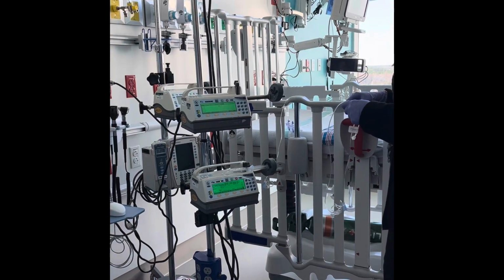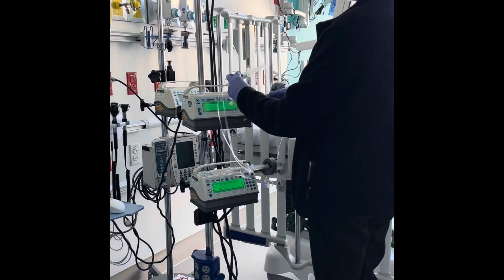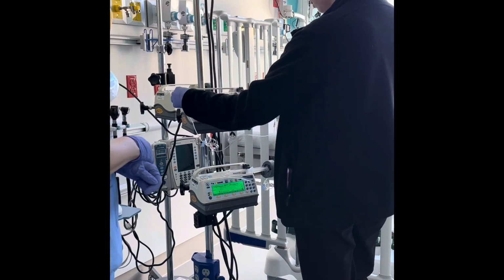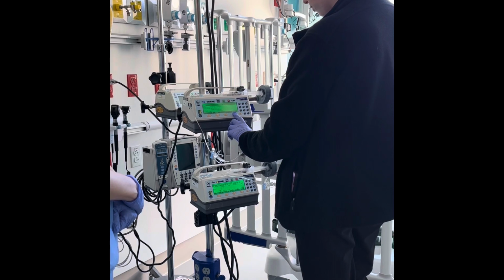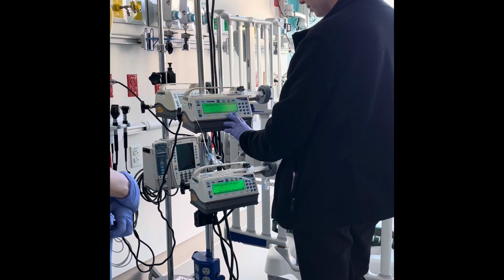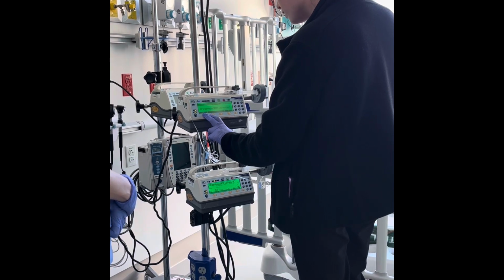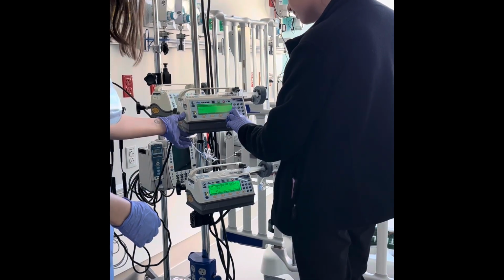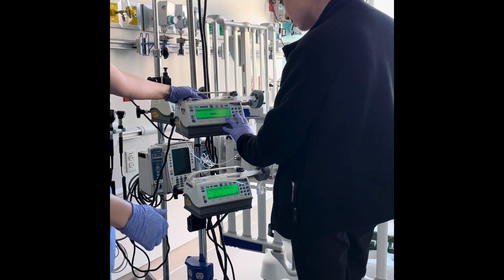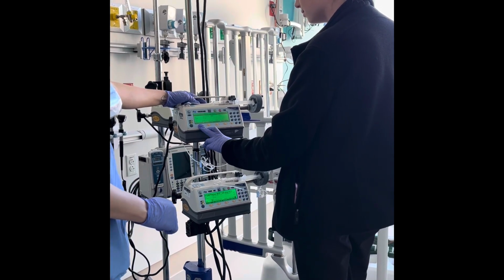Once you've received your new syringe from pharmacy, you're going to follow the 7 rights to medication administration and independent double verification. You'll prime the tubing and program the pump at 50% of the current infusion rate. So in this case, that will be 0.05 mics per kilo per minute.